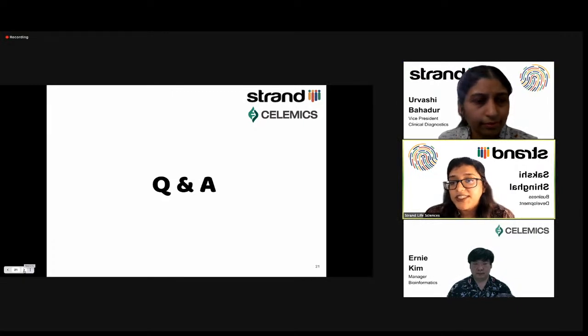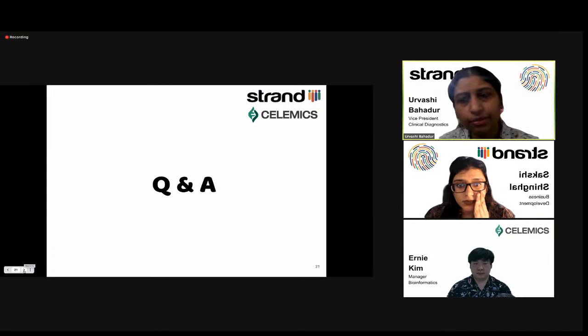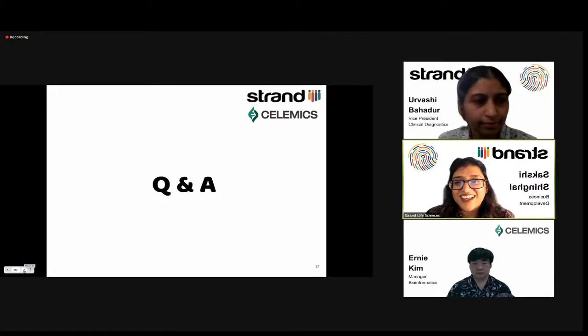So their next question is, do you also follow the VITAL tool designed by CAP during variant interpretation? We don't need to use something specific like that. We've incorporated multiple things in StrandOmics itself for us to understand whether the variant is gain of function or not. We use COSMIC, and we use germline databases to find out the allele frequency. We use bioinformatic predictors. So we use a combination of all these, and that's how we understand whether the variant is important or not. Got it. Thanks so much.